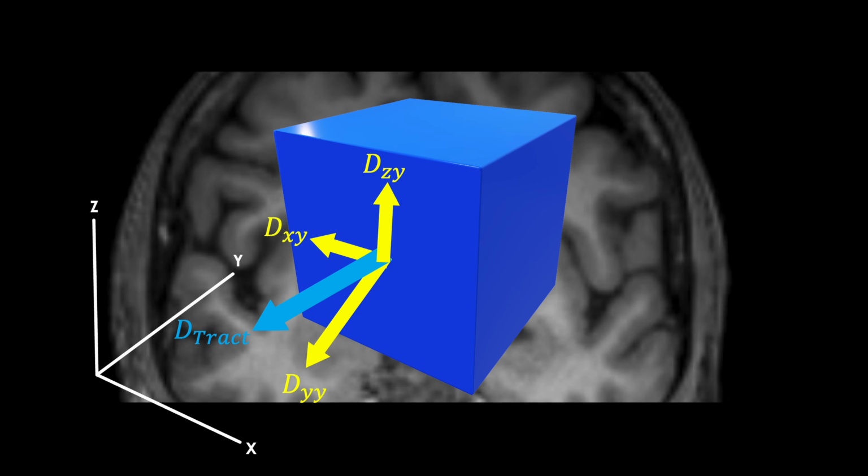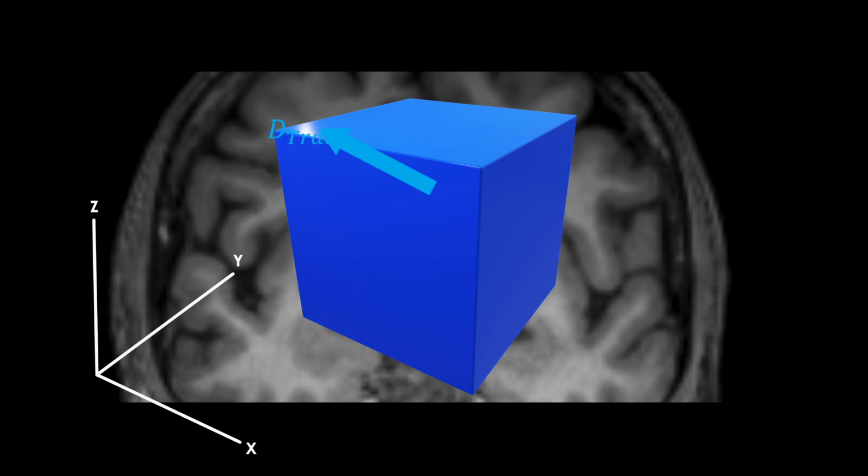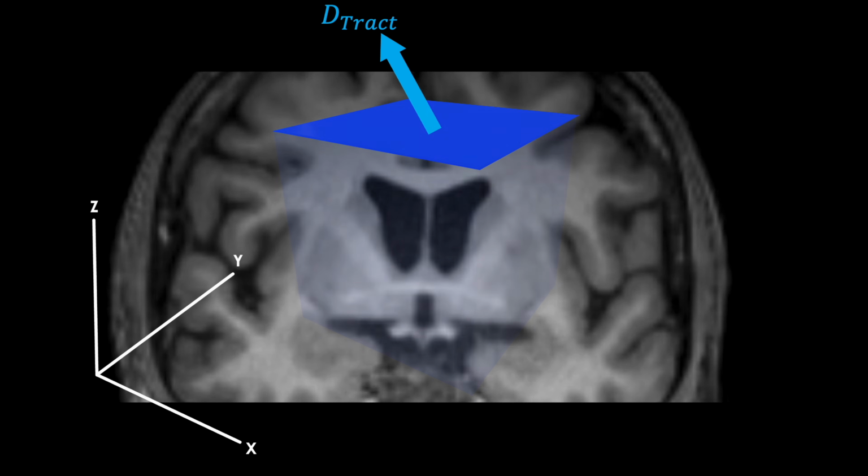Finally, if our diffusion happens to be through our z surface, we'll have a component perpendicular to the surface and parallel to the z-axis, dzz, and 2 components parallel to the surface z, a dxz and a dyz. I know this is complicated, but we're so close to solving this. Stick with me a bit longer.